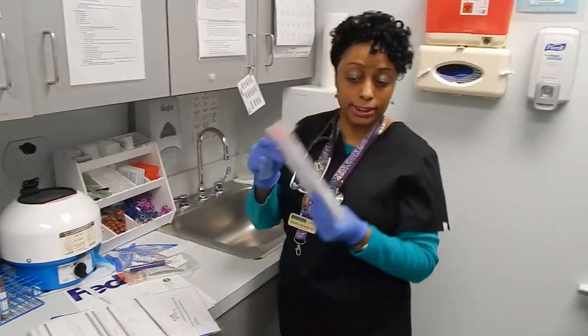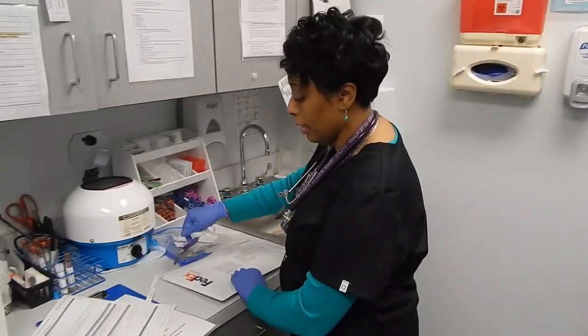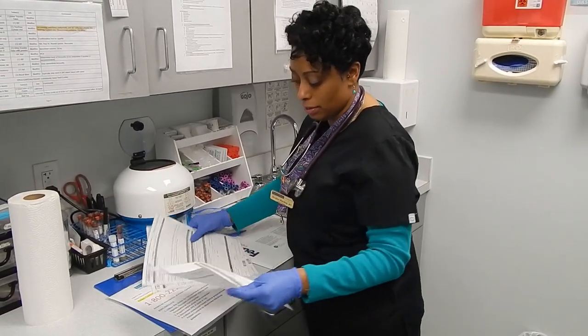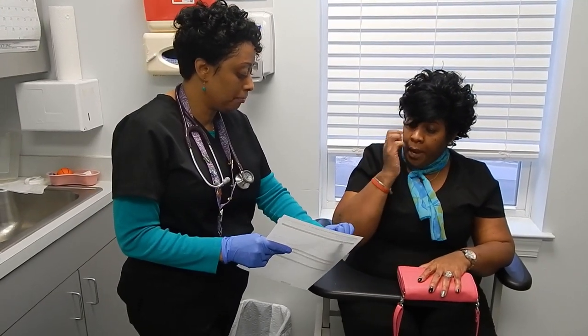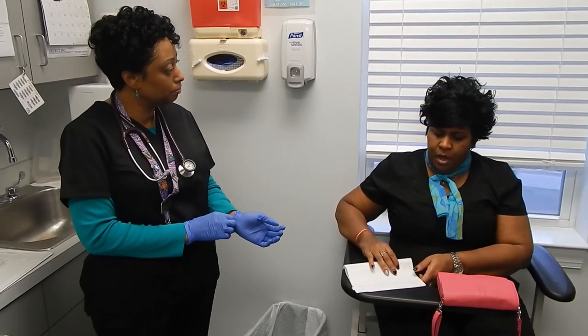I want you to see that this is sealed. This is sealed as well. I'm going to give you a copy of the paperwork — I want you to hold on to this. During the process, if the lab or the doctor needs to call you for any information, you need to refer to this number right there. That's your copy. Do you have any questions for me, Ms. Wood? No, thank you.